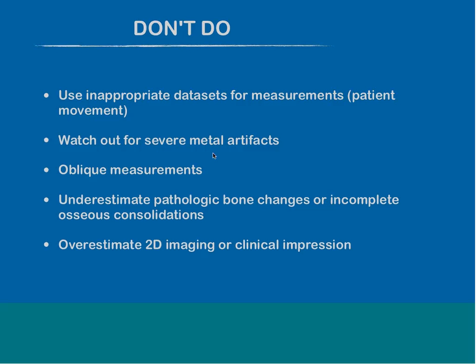And finally, when we are talking about CBCT, I have to say this at least one time: do not overestimate the information on your 2D imaging or your clinical impression when you compare it with your CBCT results. So please be aware that any information you generate out of a panoramic image is more or less not the same in value when you compare it to your cone beam CT data set.